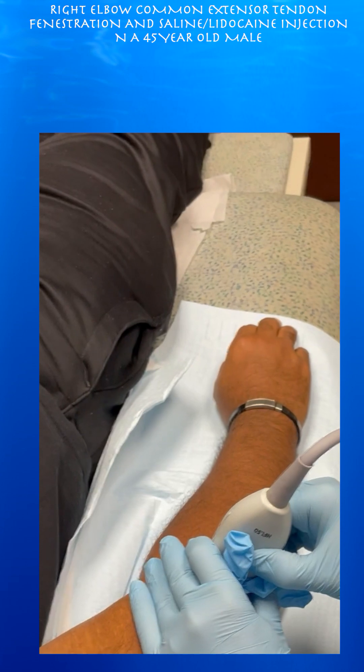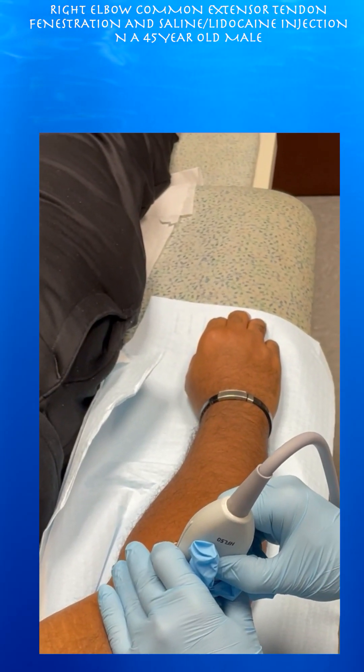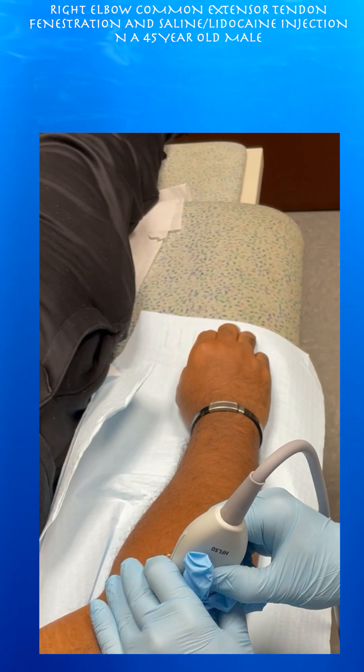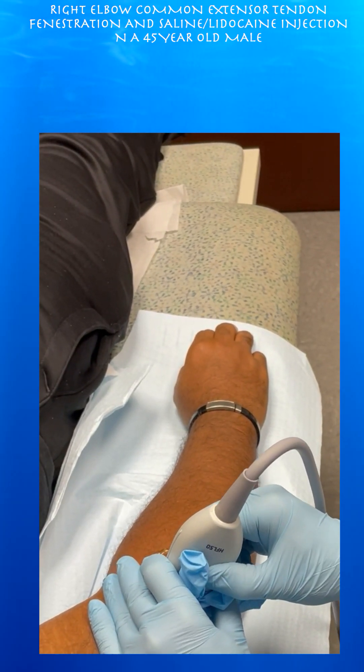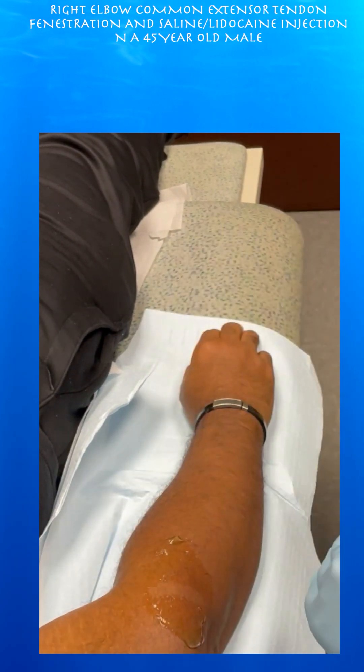We talked about options. My preference was PRP, but he's not quite ready for that, so we're just going to fenestrate the tendon and inject some lidocaine. Cortisone is really kind of out of favor these days, especially if you may have some partial tearing that may make it worse. So we're just going to try to fenestrate it and elicit some blood in that region to hopefully help with some healing.